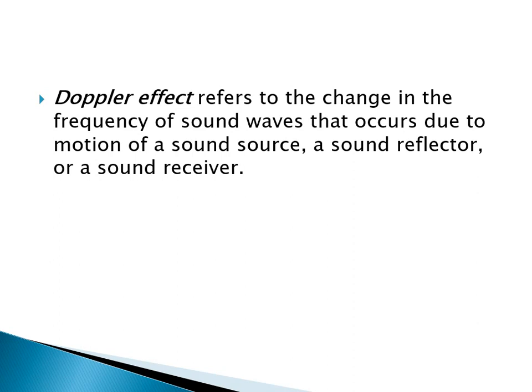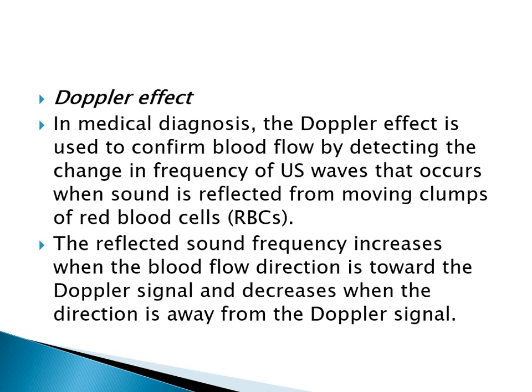We should know something about the basics of Doppler ultrasound. First thing is the Doppler effect, which refers to the change in the frequency of the sound wave that occurs due to motion of the sound source, a sound reflector or a sound receiver. In medical diagnosis, the Doppler effect is used to confirm blood flow by detecting the change in frequency of the ultrasound wave that occurs when sound is reflected from moving clumps of RBCs. The reflected sound frequency increases when the blood flow direction is toward the Doppler signal, and it decreases when the flow is away from the Doppler signal.